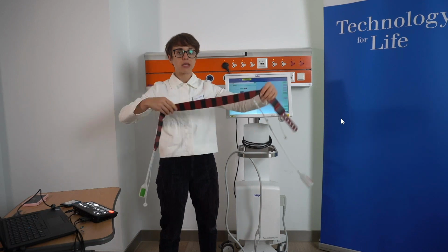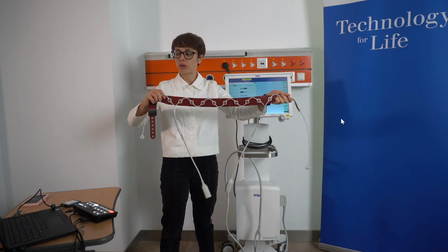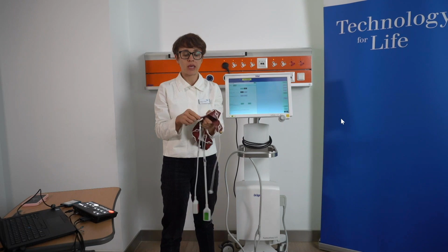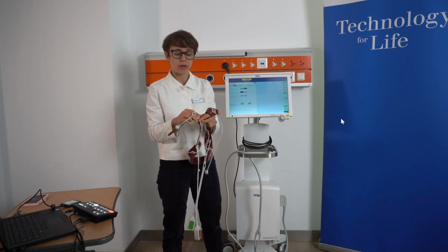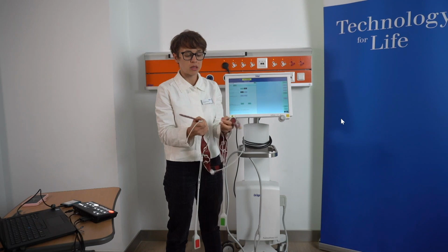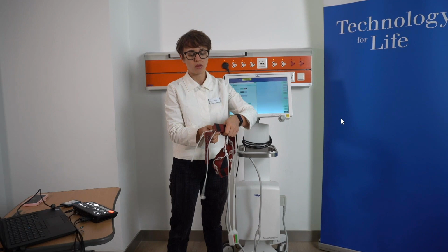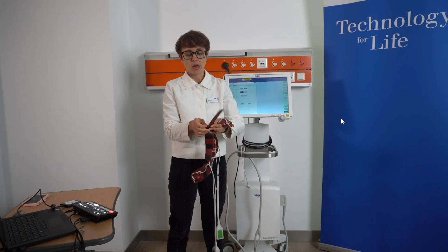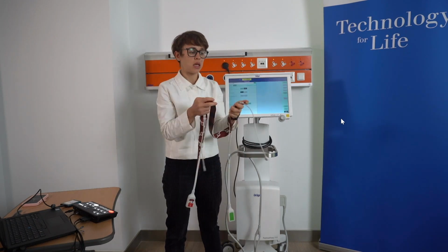The cable consists of two parts. We have the silicone belt, you can see here the red one, and we have the cable itself, the signal cable. You can connect the silicone belt and the cable together by just easily pressing them together. There is also an indication for the easy connection.